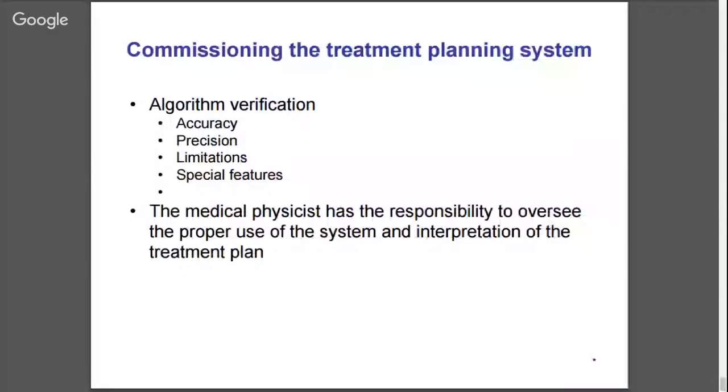Okay, so for example, this probably means small field geometries. If we're using very small fields, low monitor units, which we might use in VMAT and IMRT type treatments, then we need to understand the limitations of our treatment plans. Okay, so that's a brief summary of the acceptance testing and commissioning process that we need to undergo for the linear accelerator system.